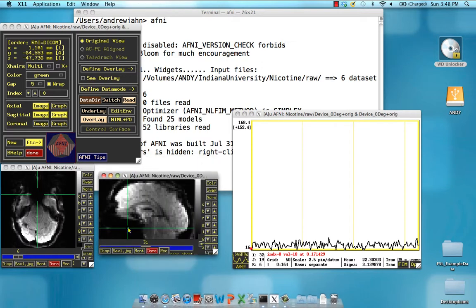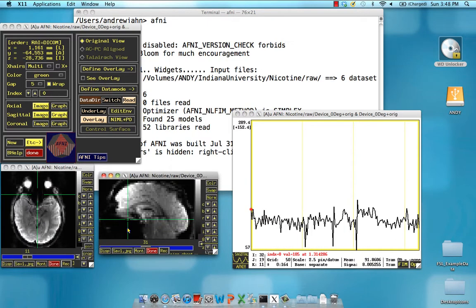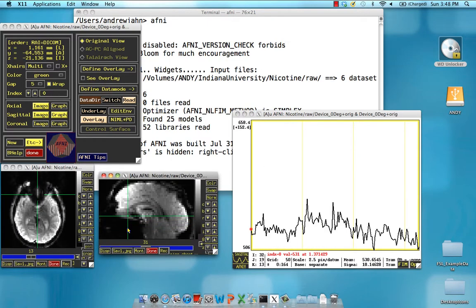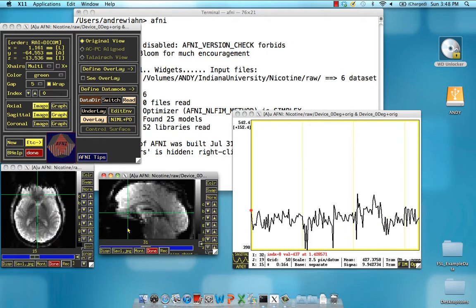It's just to show you that I'm not lying. So the point here is, each slice is acquired at a different time, and slice time correction will try to interpolate the time course of each and shift it so that it is as though they're acquired at the exact same instant.